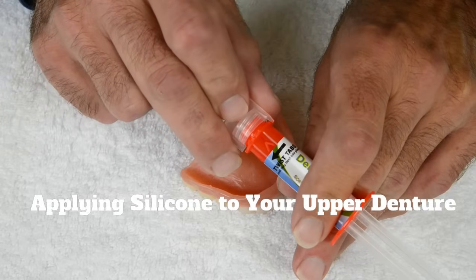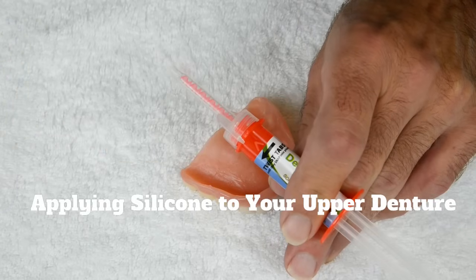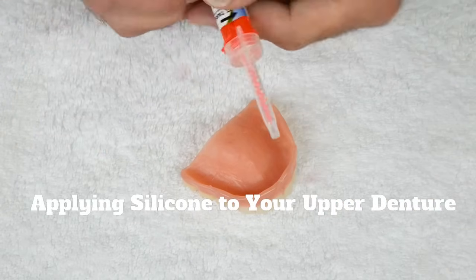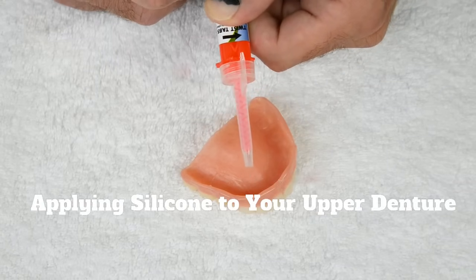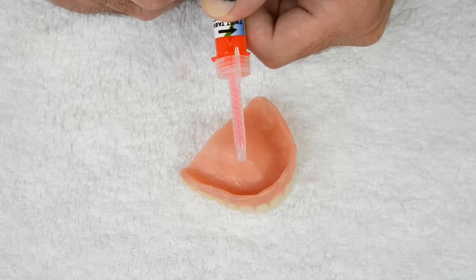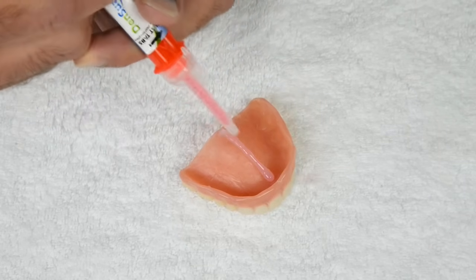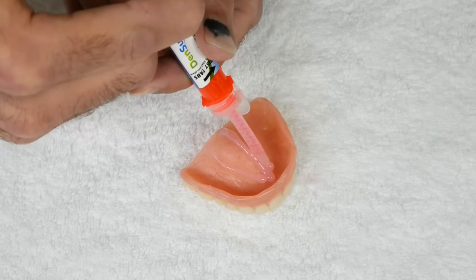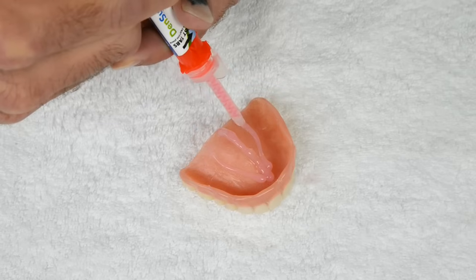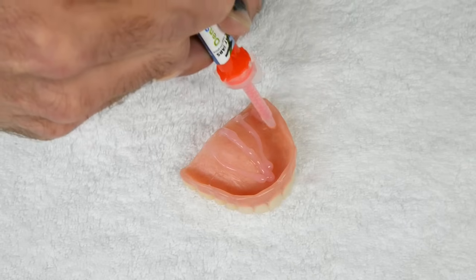Now press the plunger and watch it come through the mixing tip — this can take a few seconds to get started. Start with a thicker line down the center of the palate. Next put a medium line on the left, then a medium line on the right. Now put the remainder in the trough, starting at one end and going all the way around to the other end, back and forth until it's all gone. See how fast I'm working — now get it up in your mouth!